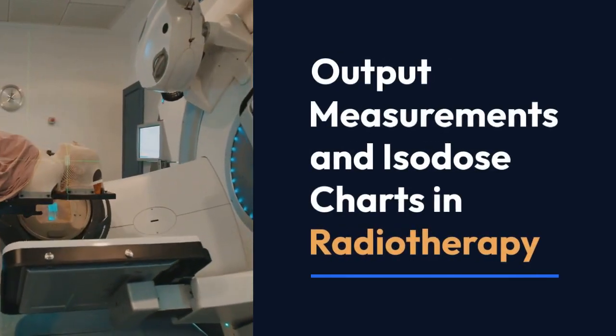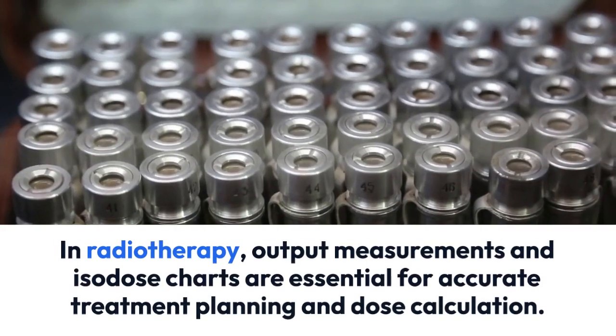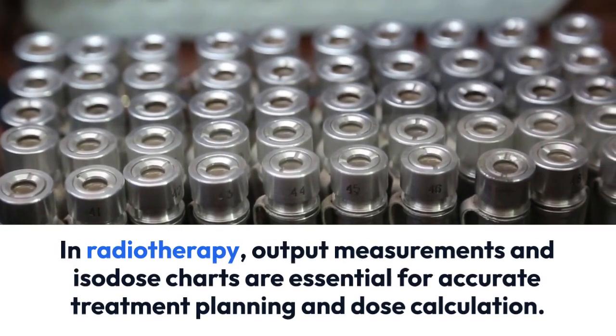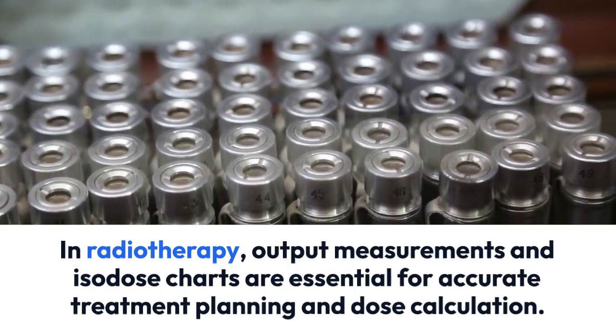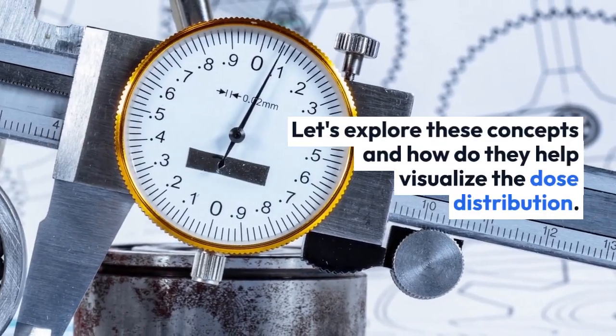Output measurements and isodose charts in radiotherapy. In radiotherapy, output measurements and isodose charts are essential for accurate treatment planning and dose calculation. Let's explore the concept.